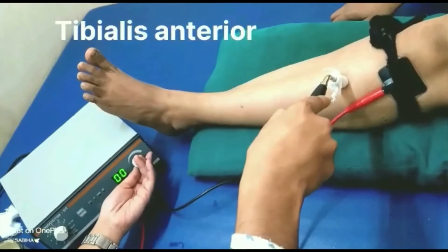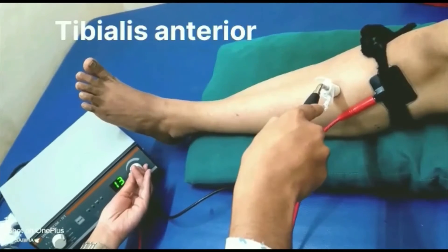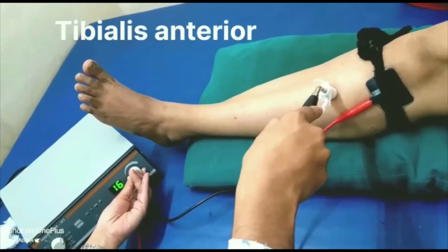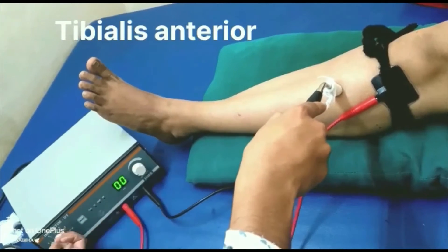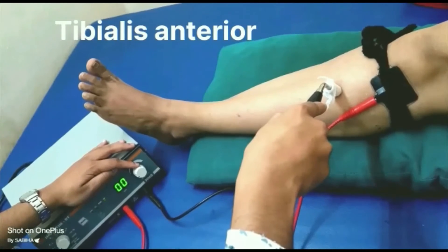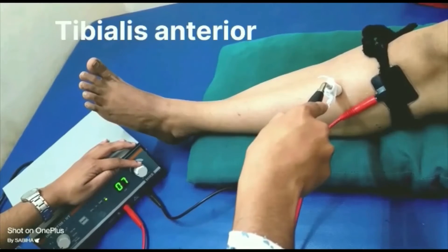Set the machine to IG mode with pulse duration of 300 milliseconds and increase the intensity gradually until minimal muscle contraction is visible.